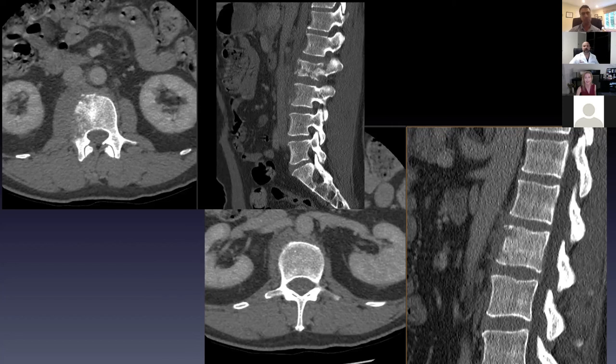What gets my attention is that top left panel on my screen where the perivertebral tissue is so inflamed and so thickened, there's asymmetry there, and very few things cause that. So that's what I would think. Okay, so you're not going to help this poor guy. You're just asking for more information. So I'll try, but poor guy, I guess you won't.